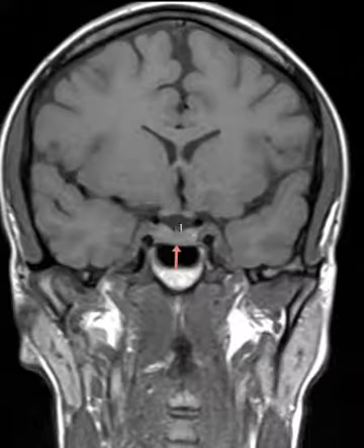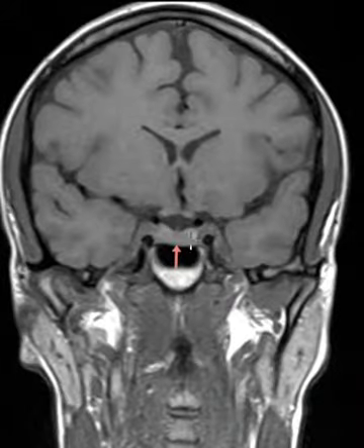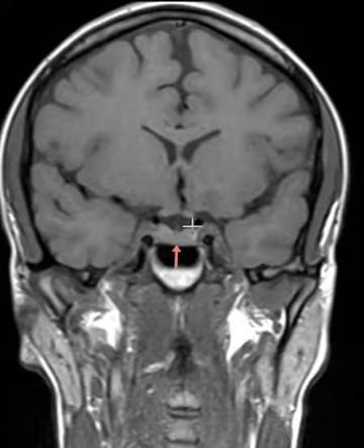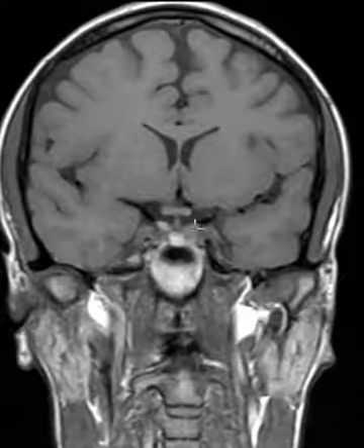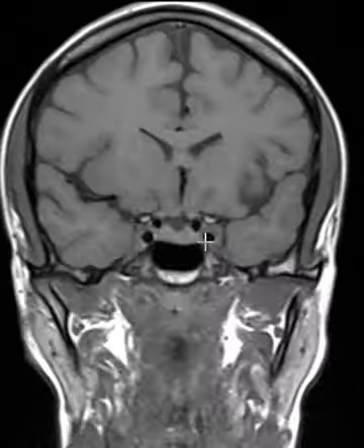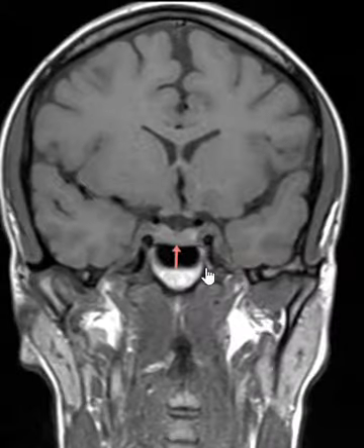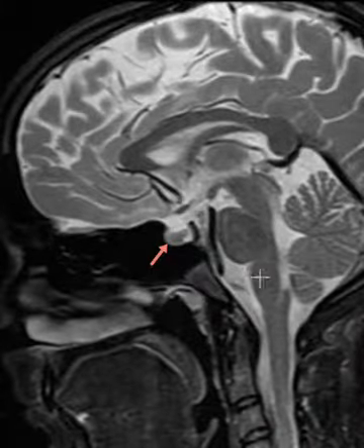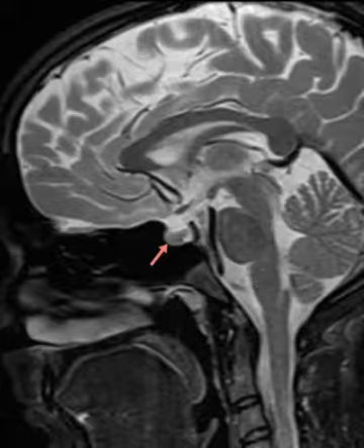When there's a pituitary mass, one side will often be larger than the other, or it'll bulge up into the suprasellar cistern, this area above it. Or the pituitary stalk will be deviated to the right or left. So this is what we look for, and this is how you read an MRI of the pituitary gland.